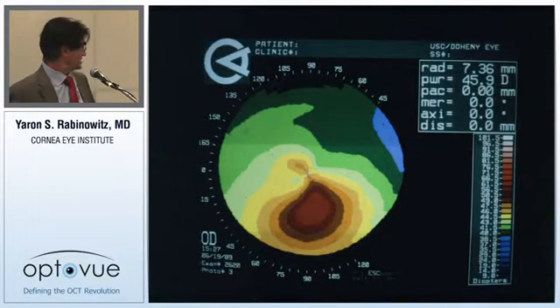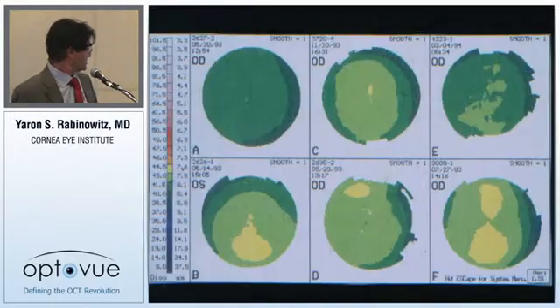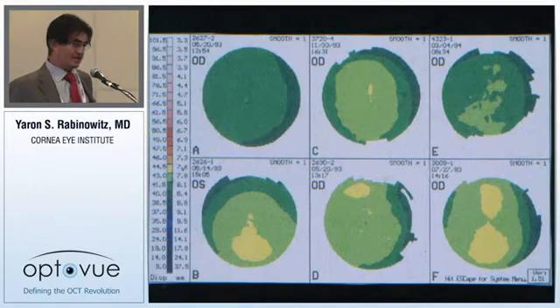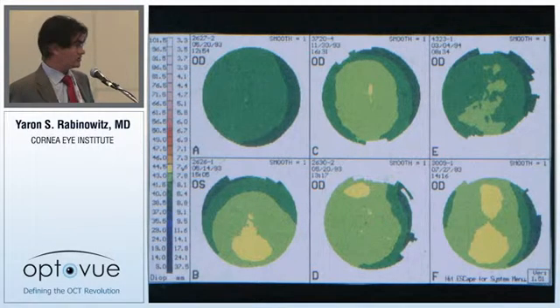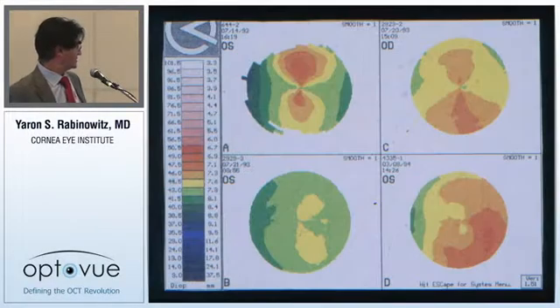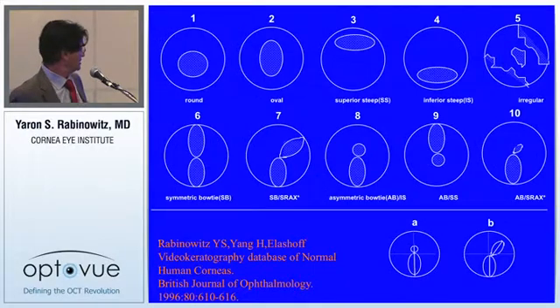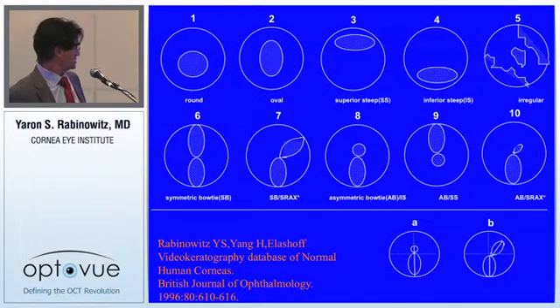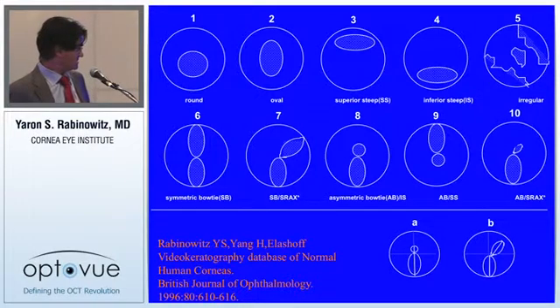A typical keratoconus patient shows inferior steepening and asymmetric bowtie with skewed radial axis topography. To rule out subtle forms, you must know what normal topography looks like. The asymmetric bowtie with skewed radial axis pattern is found in only about 0.5% of the normal population, but is a similar pattern to that seen in patients with clinically obvious keratoconus.